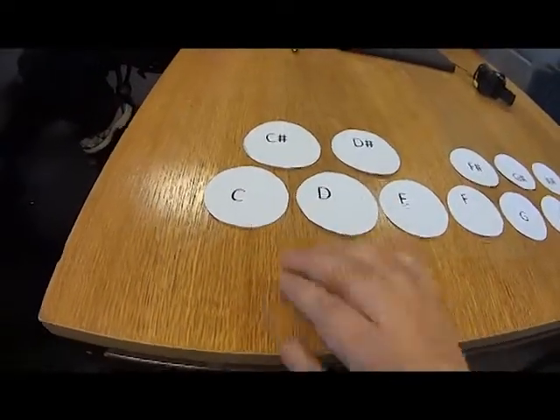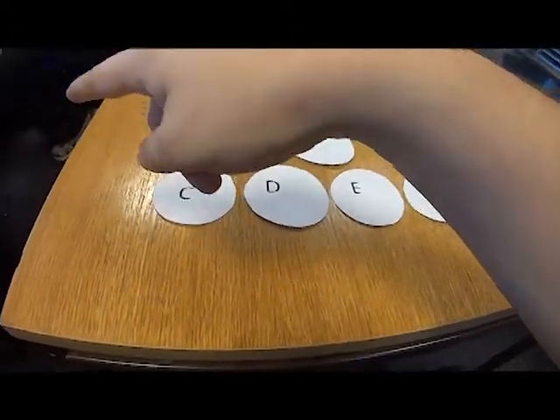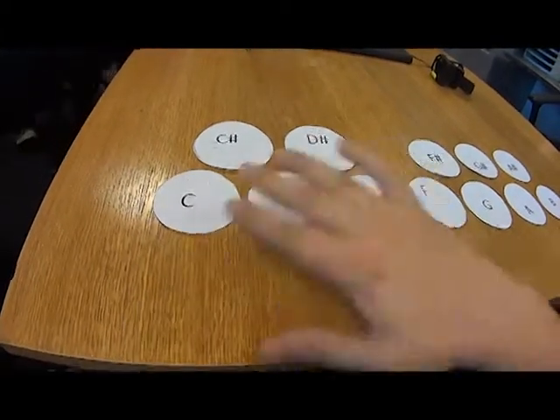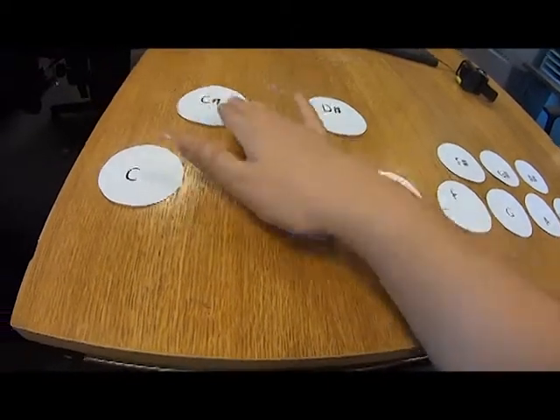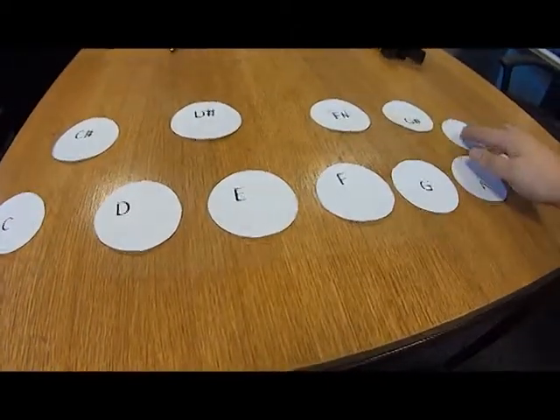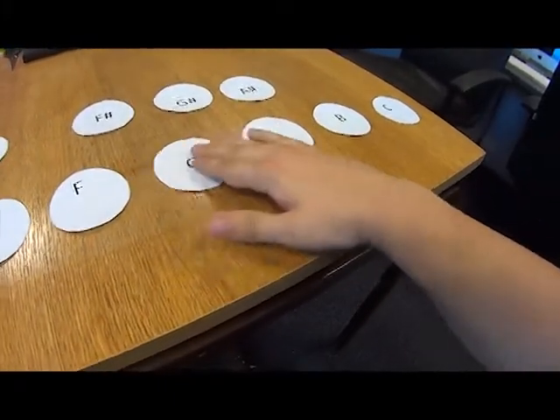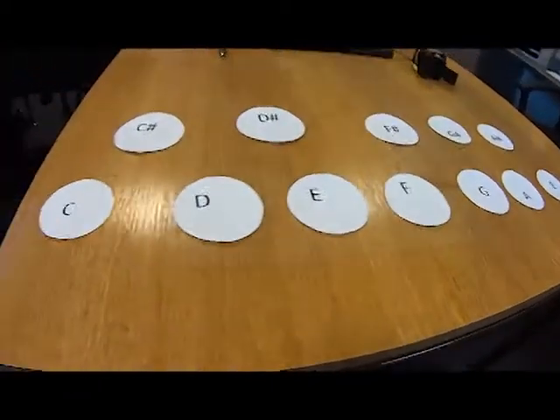Basically, the idea is that it'll be connected to an Arduino or a Raspberry Pi, probably an Arduino at the moment, that allows you to play the instrument. You can move the buttons around, so you can space them out, move them up or down, so as people's rehabilitation improves, all of that can be adapted for their level of interaction.